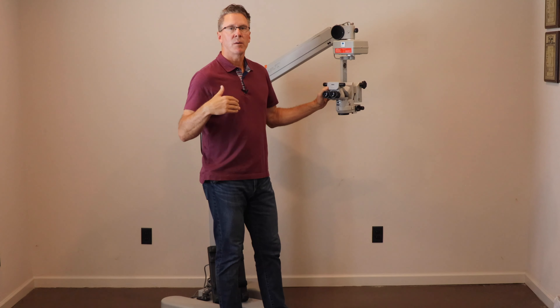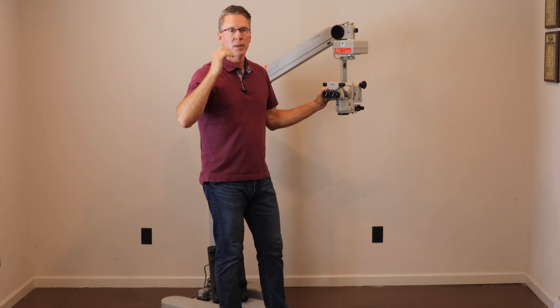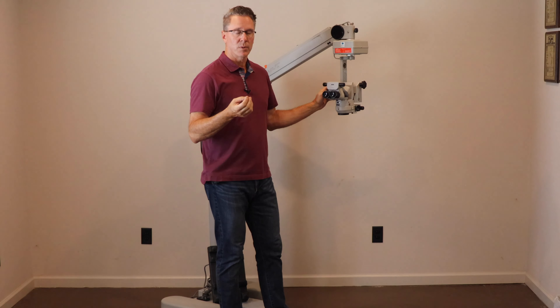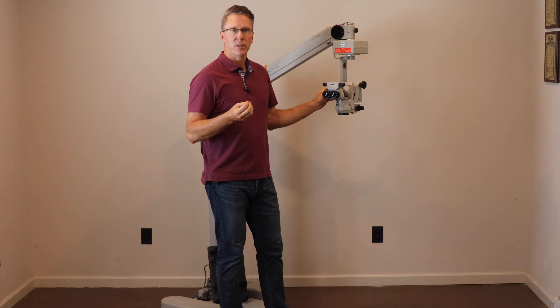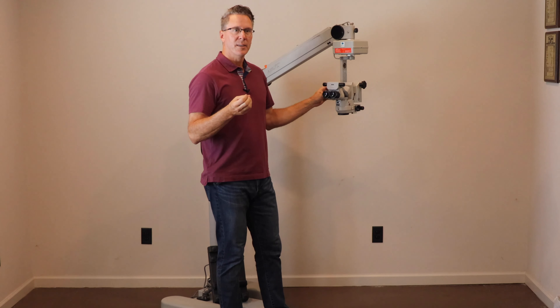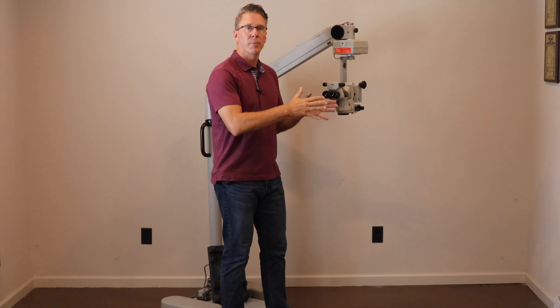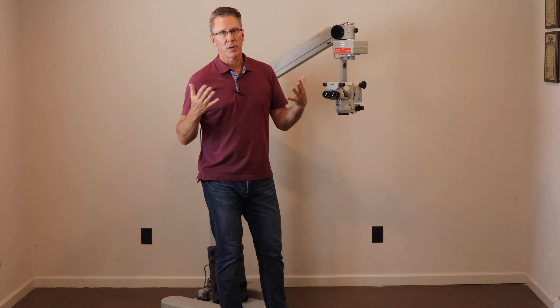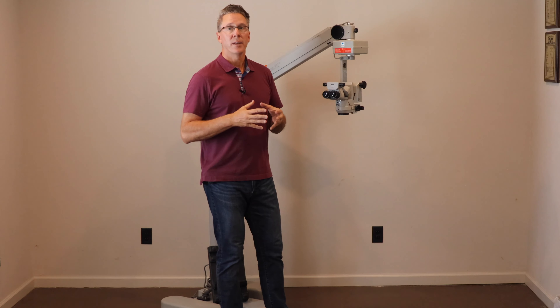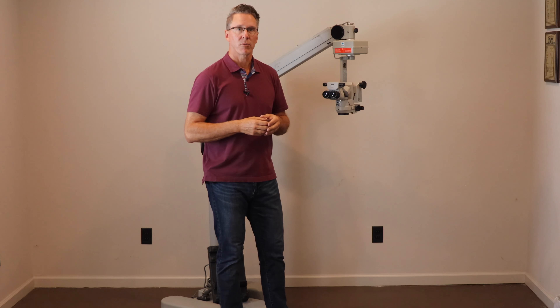The team here at Surge Instruments came from a company called Endure Medical. At Endure, we developed, we patented, and then we started selling the Illumini module. The Illumini is an illumination system that we can put on older microscopes to make them optically just as good — actually, in my opinion, better than the new Zeiss Lumera or Alcon Luxor microscopes.